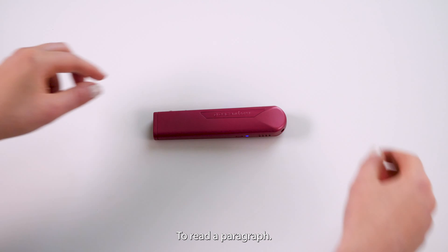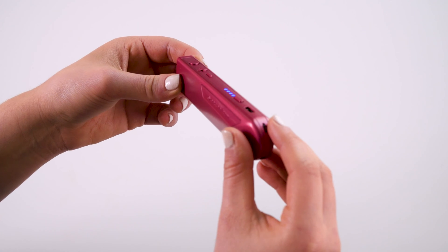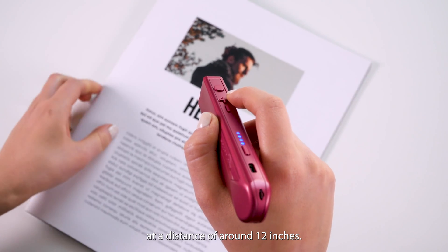Reading text. To read a paragraph, a full page of text, or a digital screen, hold OrCamLearn steady, directly facing the text at a distance of around 12 inches.